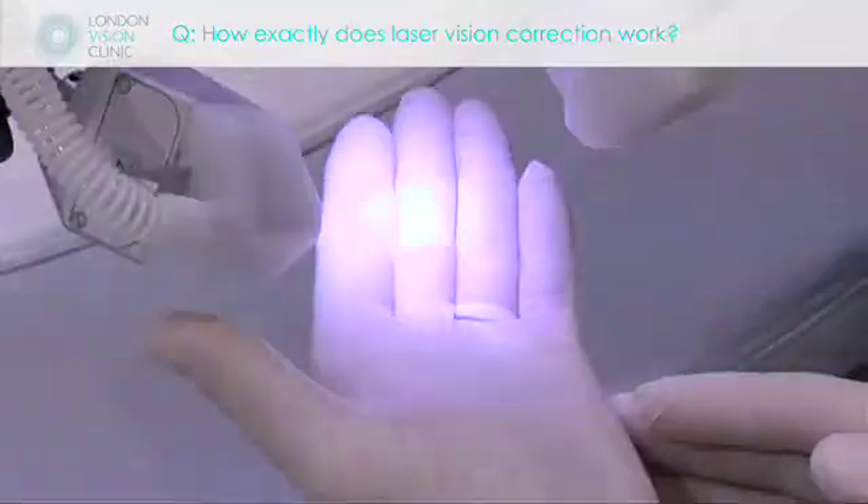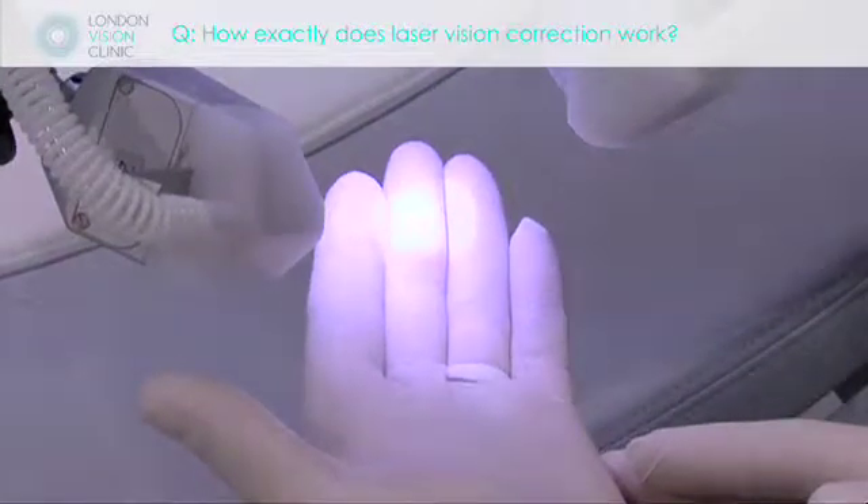It's actually an extremely light touch laser. You can put your hand under it and nothing happens.